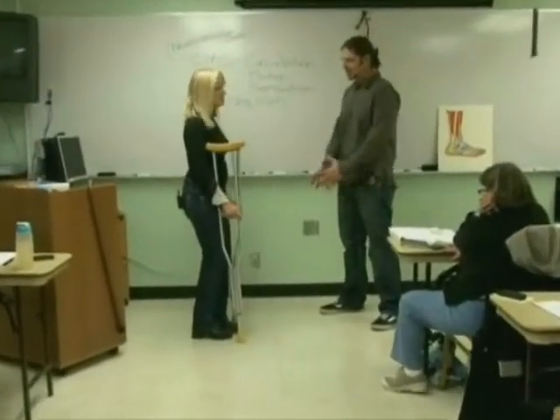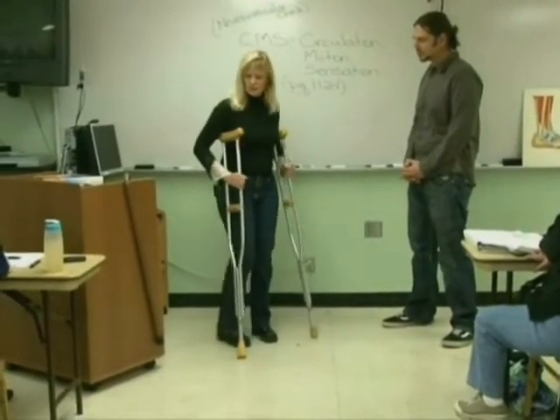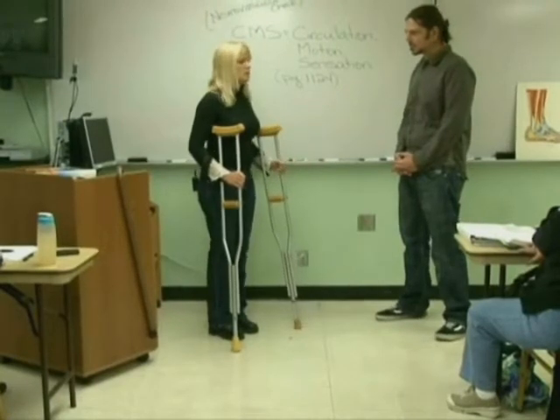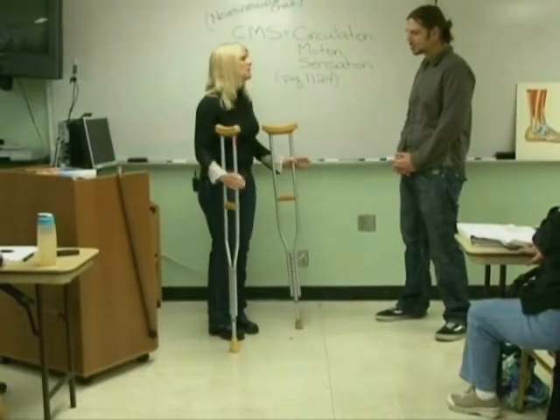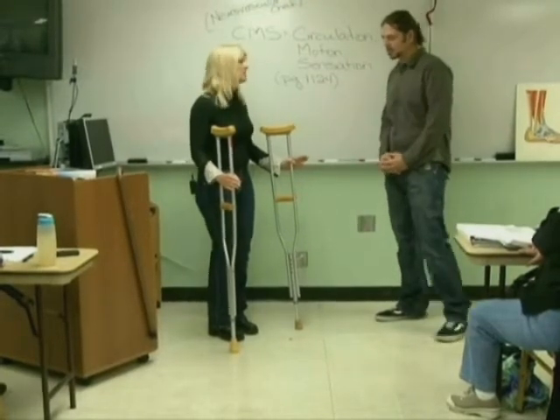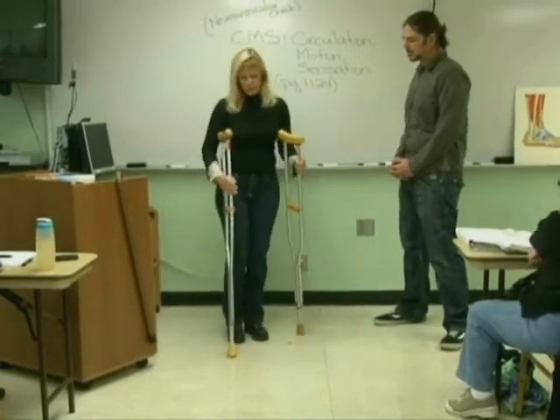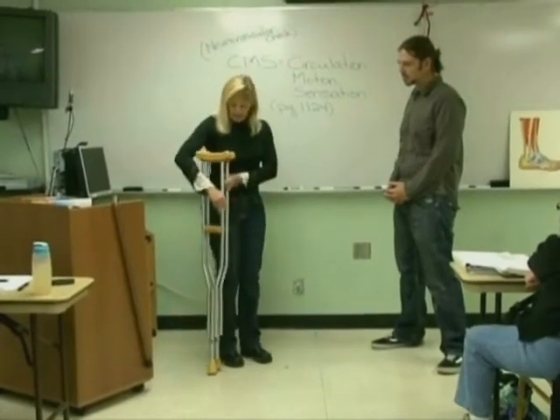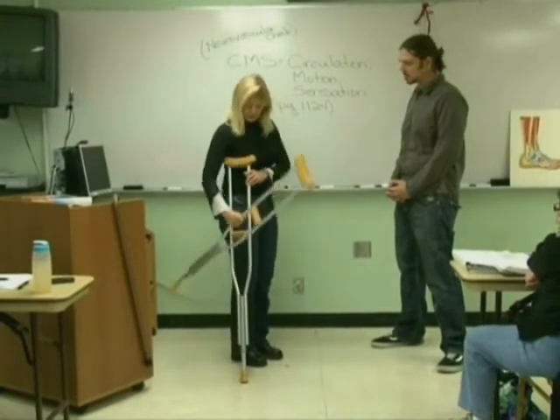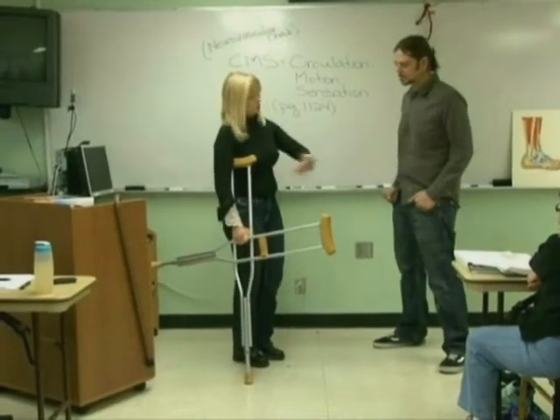I'm going to teach you how to go up and down stairs. For safety — you've got three stairs going into your house with handrails on both sides — any time you've got handrails you must use them, because it's much safer. They're secured into the concrete. How to hold your crutches: if you've got big hands you can hold them like this in one hand and use the handrail, or flip them around if you've got smaller hands and carry them up this way.